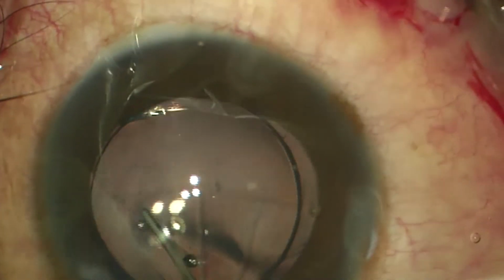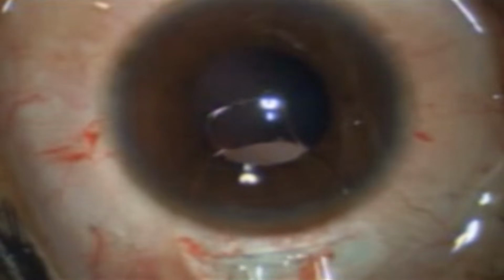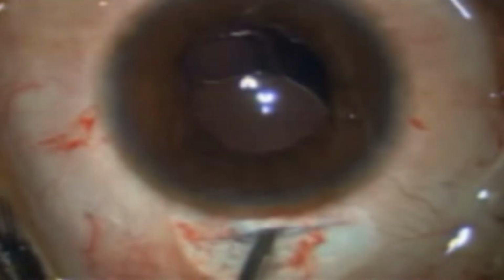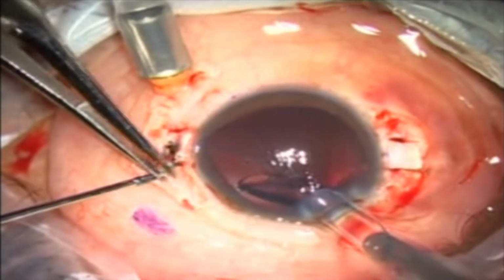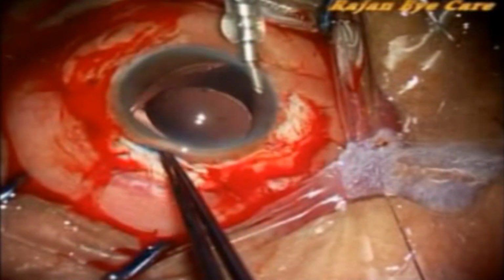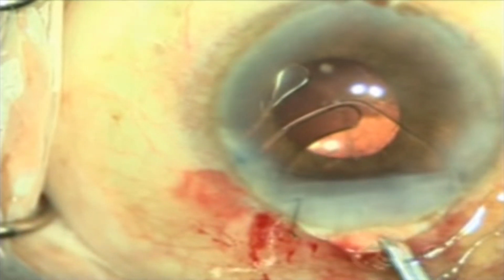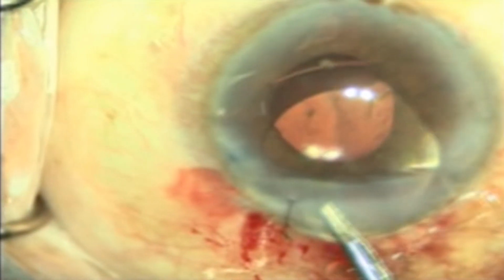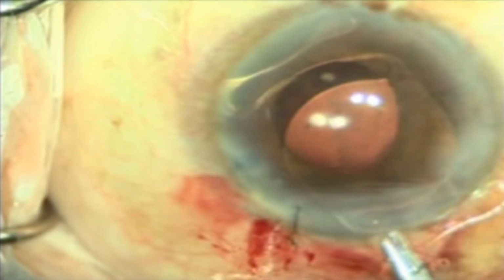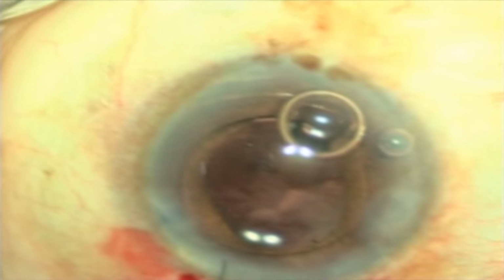If the PC tear is large, then we have to go in for a multi-piece lens in the sulcus with an optic capture, or go for a retro-iris fixated lens, or a secondary or a primary glued IOL, or a sutured scleral fixation IOL, or even an anterior chamber IOL, making sure a peripheral iridectomy is being done for patients with anterior chamber IOLs.